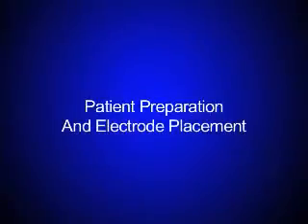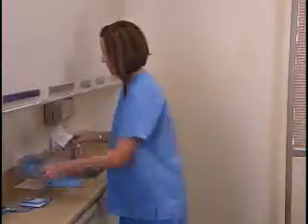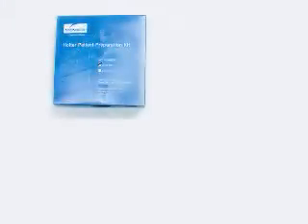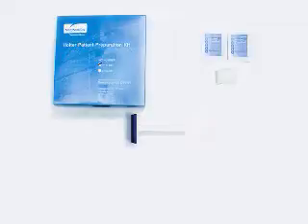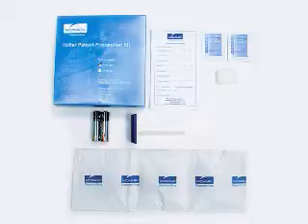Next will be an overview of the proper patient preparation and electrode placement for the test. It is suggested that you have all items needed for patient preparation set out and easily accessible. The Midmark Prep Kit comes with the following items for correct patient preparation: 1 disposable razor, 1 abrasive pad, 2 alcohol pads, 5 electrodes, 2 AA batteries, and 1 patient diary.